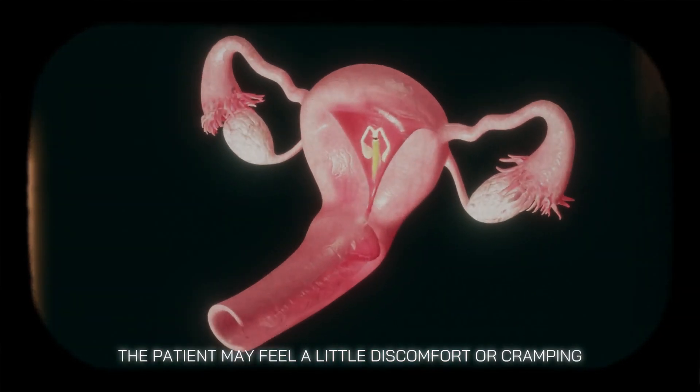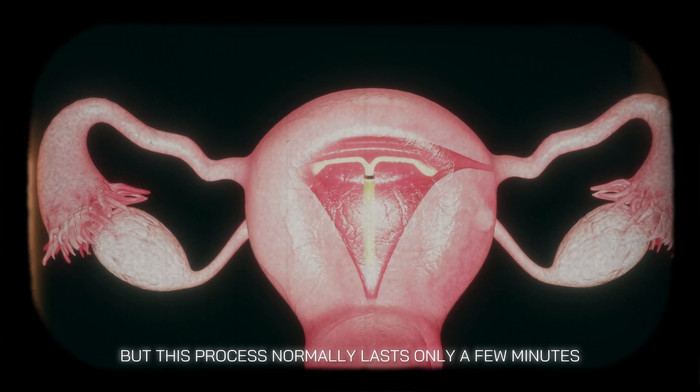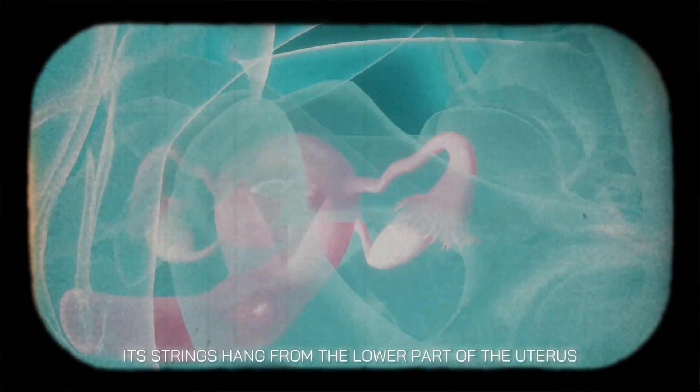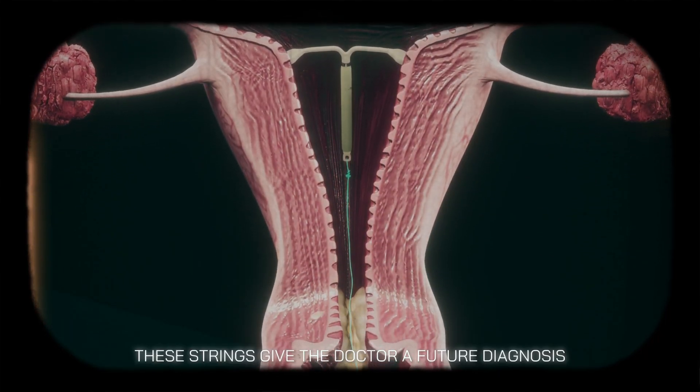During this, the patient may feel a little discomfort or cramping, but this process normally lasts only a few minutes. When the IUD is set in its place, its strings hang from the lower part of the uterus to the cervix. These strings allow the doctor to check the IUD's position during future examinations.